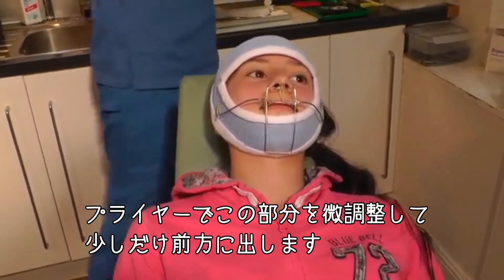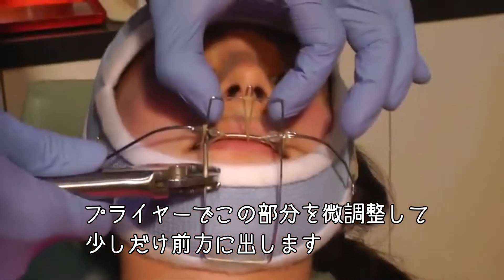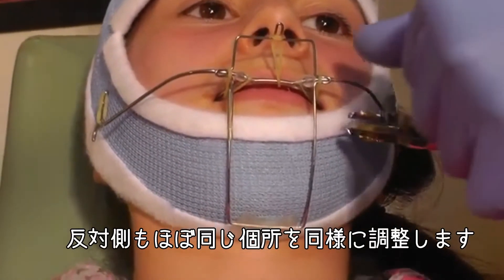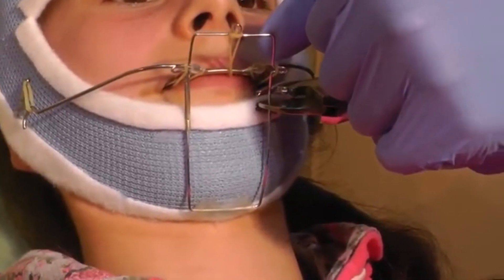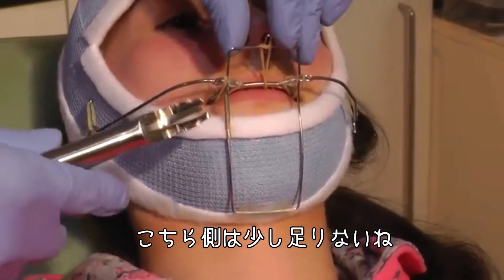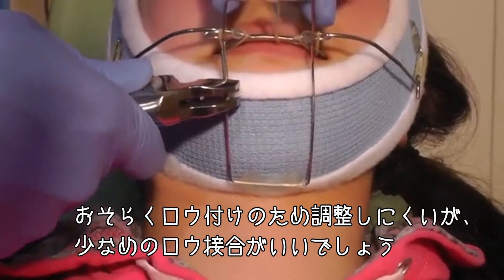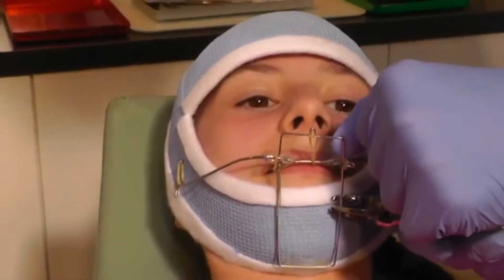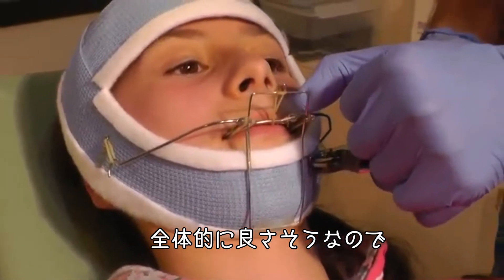Now I'm going to come back with my pliers and just tweak this forwards. That's nicely come forwards, and I'll tweak the other side to roughly the same position forwards. A little bit less on that side — that's probably where it's soldered, so we're going for a slightly smaller solder joint. Right, that's all looking good.